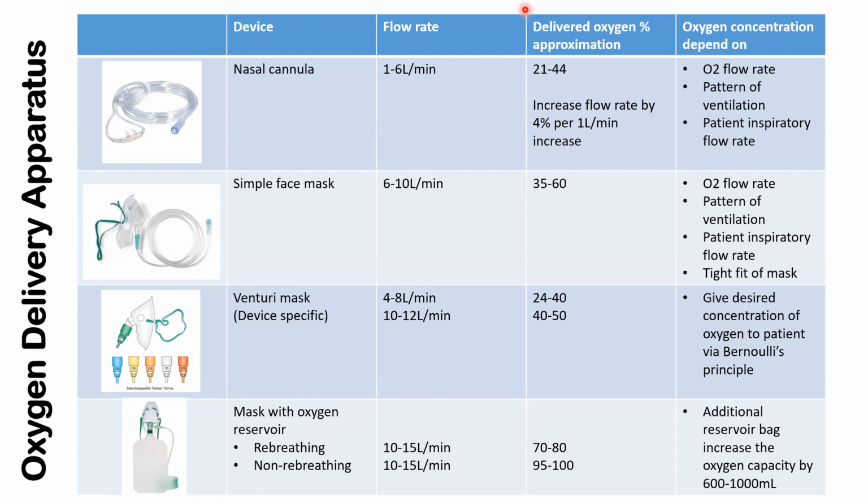Then there is the face mask, which can go up to 10 liters, delivering oxygen about 35 to 60%. The oxygen concentration depends on a tight fit of the mask, the oxygen flow rate, the ventilation of the patient, and the inspiratory effort of the patient also.